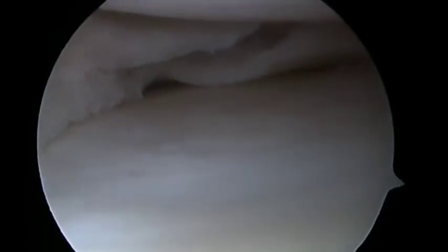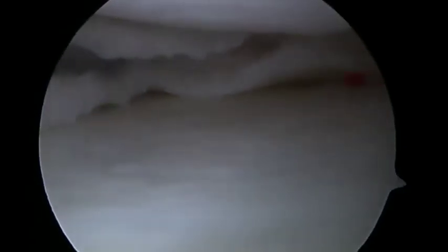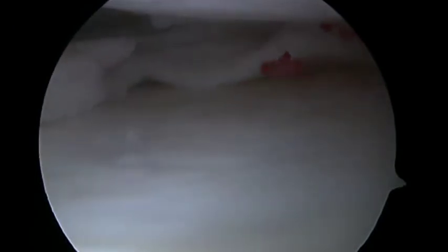Prior to proceeding to meniscal repair, a probe should be inserted and the flow should be stopped, confirming that there is bleeding from the peripheral meniscus.